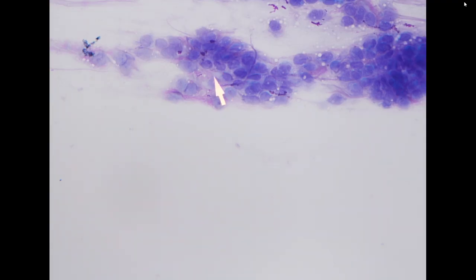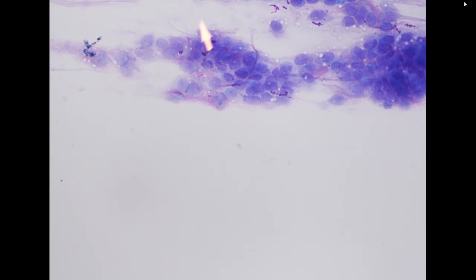It is very important that you can see in the specimen the extracellular material has a very close relationship with these myoepithelial cells. This is diagnostic for pleomorphic adenoma, because these matrices were produced by these myoepithelial cells.